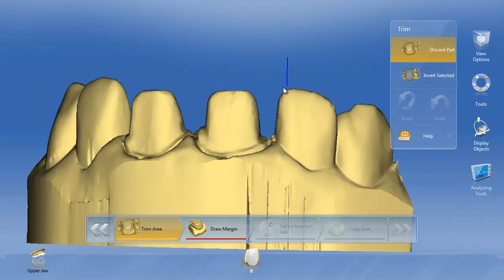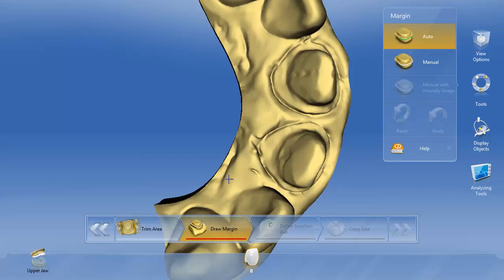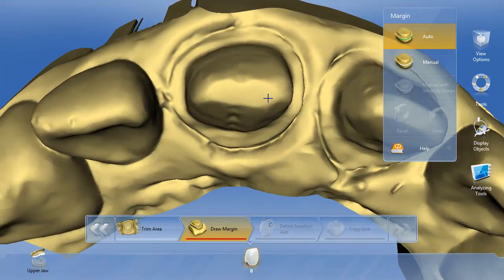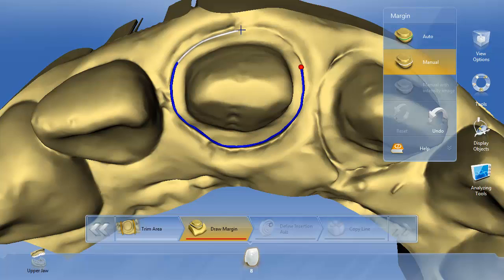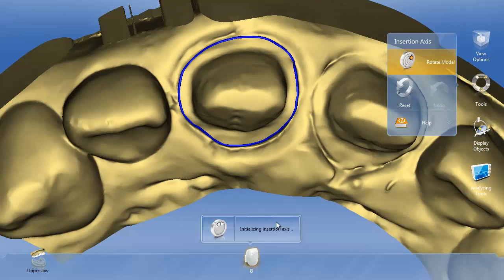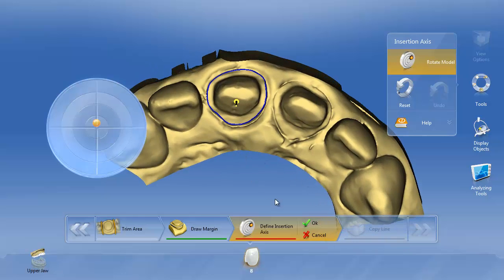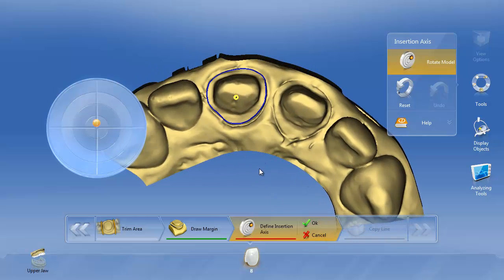We'll go to the model. When we draw the margin on this tooth we're actually going to draw the margin on the true margins. In the framework video I showed an example of drawing the margin a little bit short, but here we're going to draw it on the true margin. We'll define the insertion axis and hit OK.